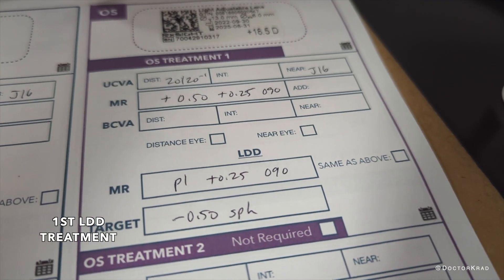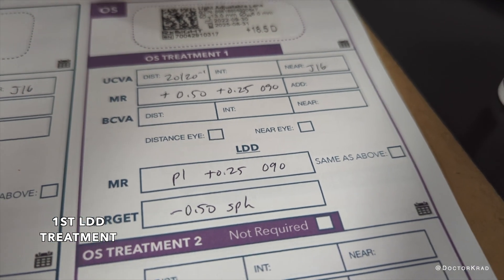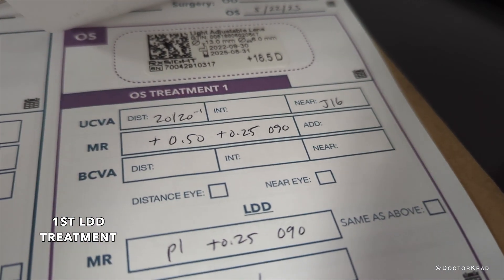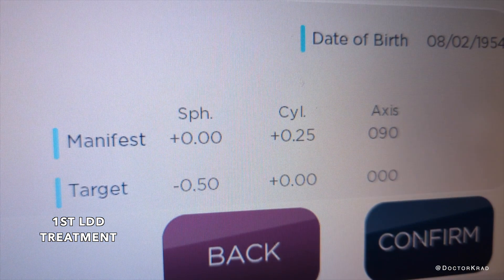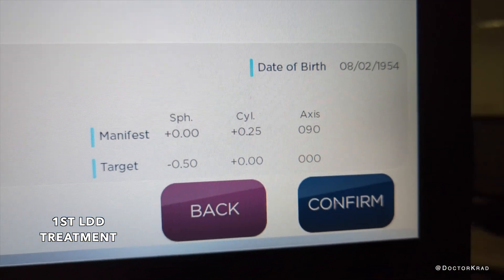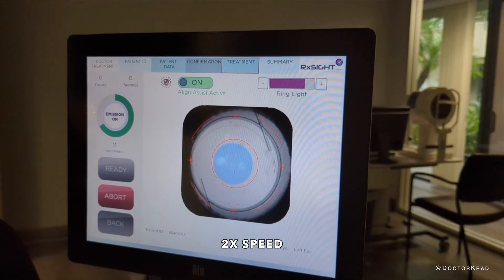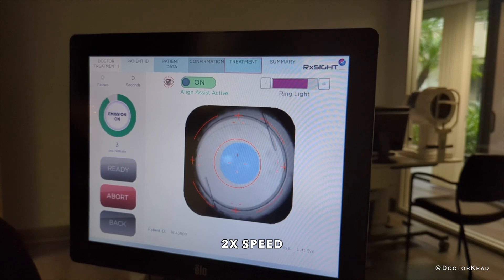In his second eye, he's plus a half, plus a quarter, but we're going to tell the machine he's plano plus a quarter. So we shifted him half a diopter, said plano plus a quarter, and we're targeting minus a half.